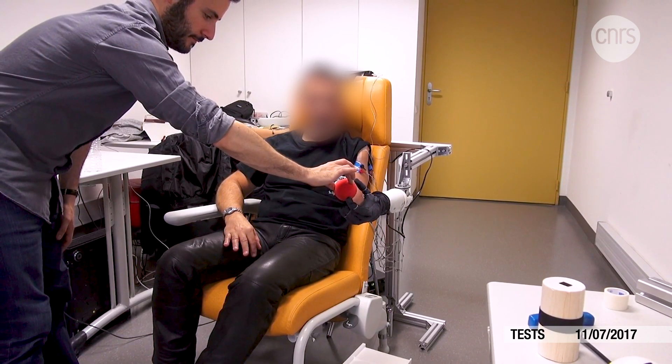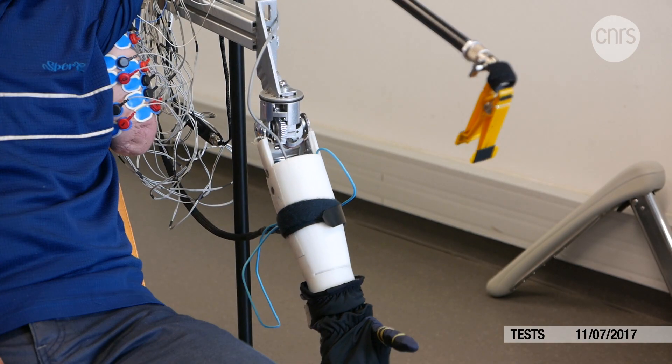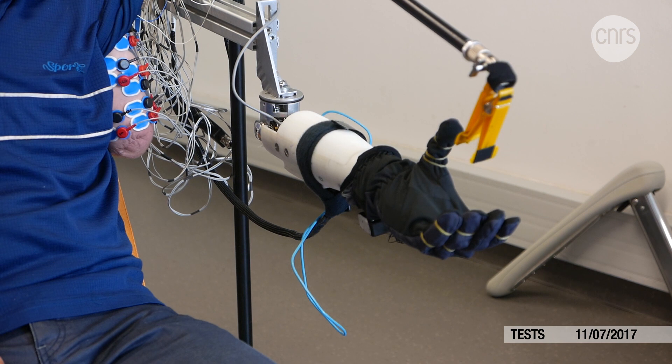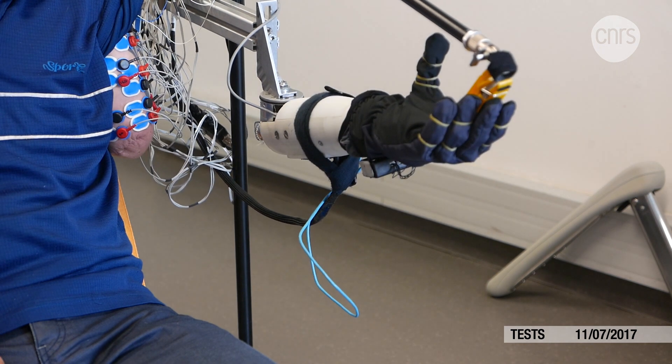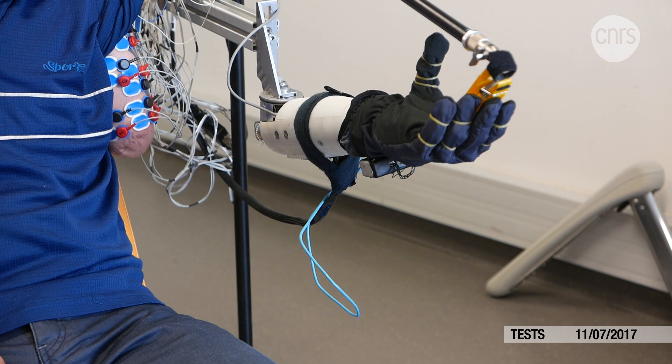As the technology is refined, comprehensive clinical attempts to control the prosthesis can be carried out. The protocol for these experiments comes in two parts. The first, which wasn't filmed, consists of creating and training the algorithm to fit the patient. We filmed the parts of the tests where the participants were in control of the prosthesis through moving their phantom limbs, in order to complete functional tasks in manipulating objects.